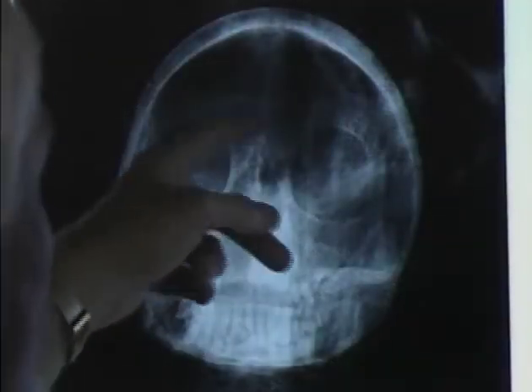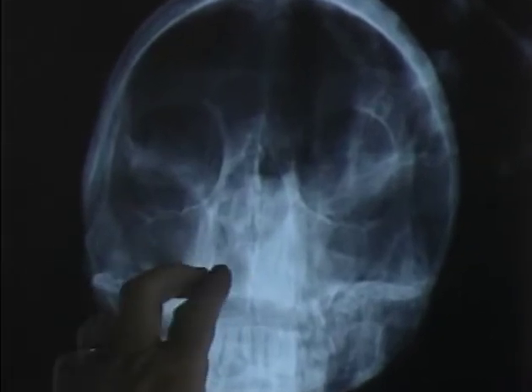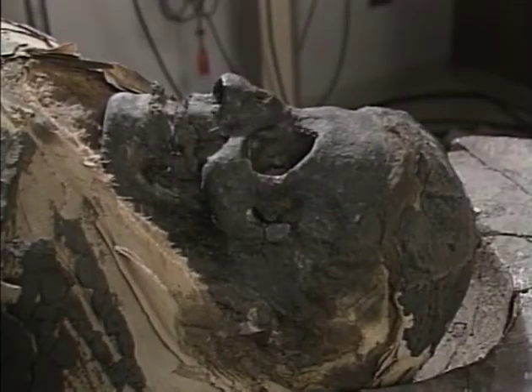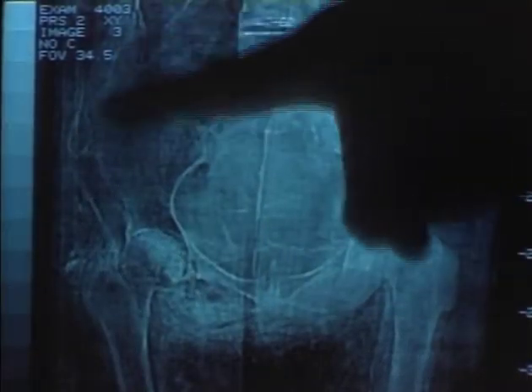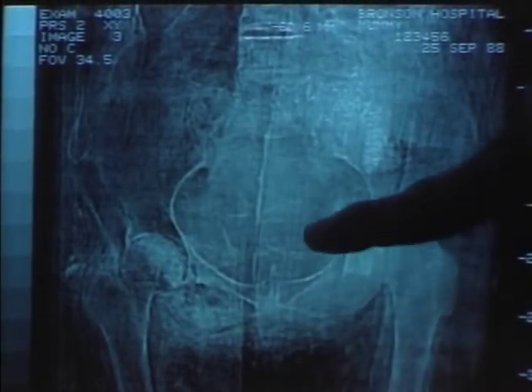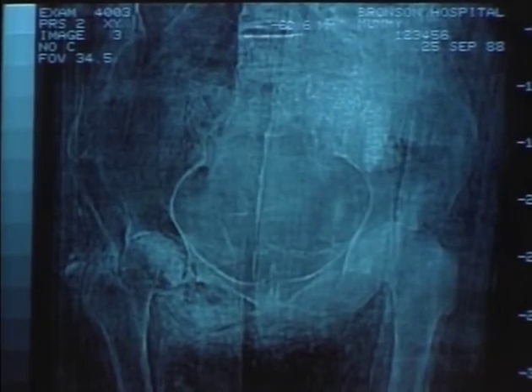This is the head. We see the eyes, they're intact. You see the sinuses. They are clear, except the central sinus region, which is white. Probably in this case, the brain was extracted through the nose. This is the pelvis, and we can tell this is a female by the shape of the pelvis. Also, I see a certain whiteness of the joint. This often follows childbirth. So she was a mother?